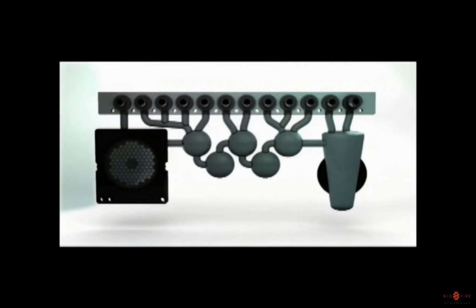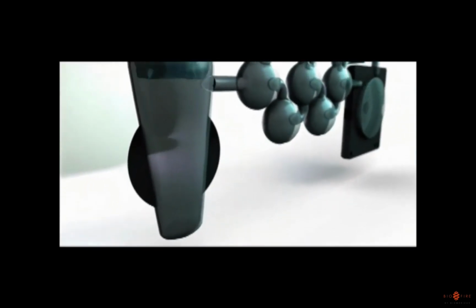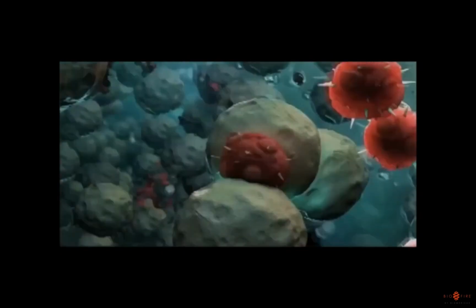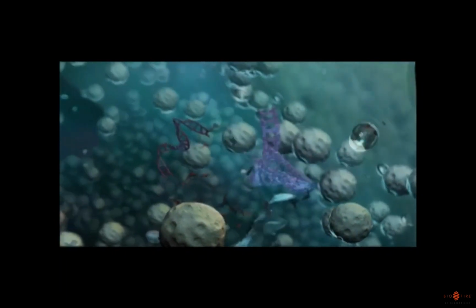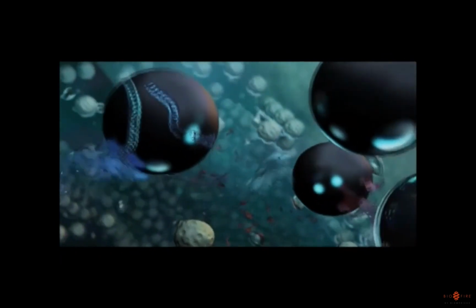Now let's take a look at what happens inside the pouch. First, the sample is moved into the lysis chamber, where the FilmArray physically lyses any cells and viruses through a process called bead beating. Ceramic beads are agitated at high speed to break open cells and viruses and release the nucleic acids. These nucleic acids are then bound by magnetic beads, which are then moved from the lysis chamber to the purification chamber.